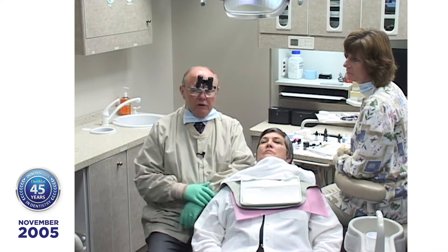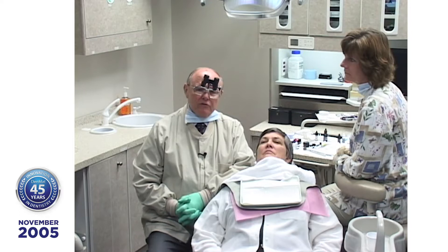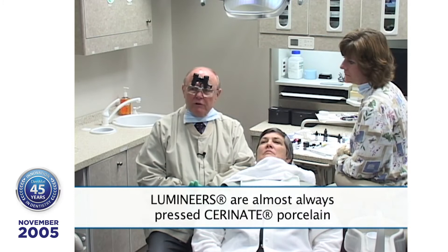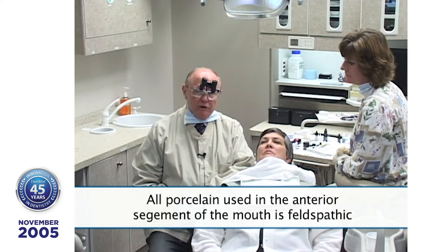I've been doing these for over 20 years. Somebody asked what makes Serenade porcelain laminates different and why are they new. We started pressing them about a year and a half ago and we call those lumineers. Lumineers are pressed Serenade porcelain almost always unless you request stacked porcelain. We hear terms like feldspathic — all porcelain we use in the anterior segment is feldspathic. The difference is it's either stacked or pressed. Pressed has more strength.